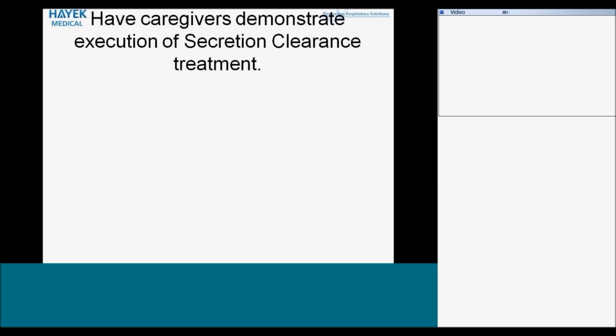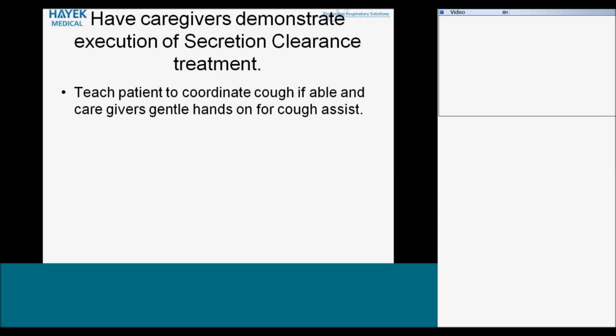Also, you want your caregivers to demonstrate execution of secretion clearance treatment. Now, something where the secretion clearance makes a really big difference for patients is if we can teach them to coordinate their own cough effort. Even if it's extremely weak, if they have any ability to cough at all, we want them to coordinate it with the cycling of the RTX.